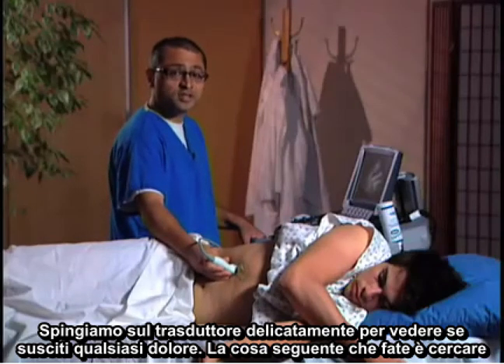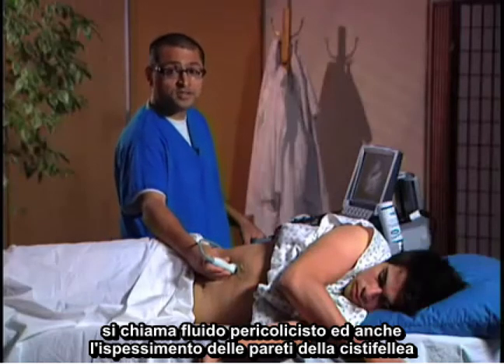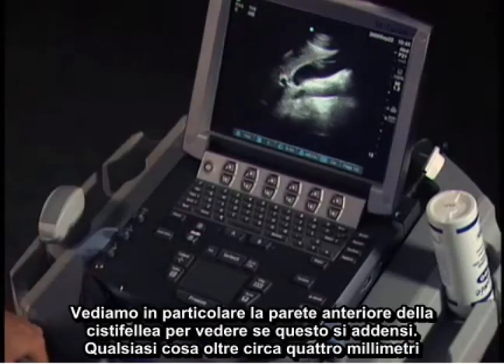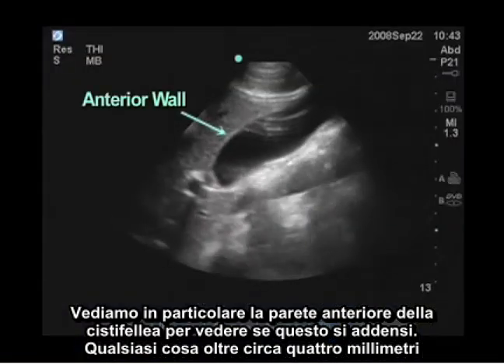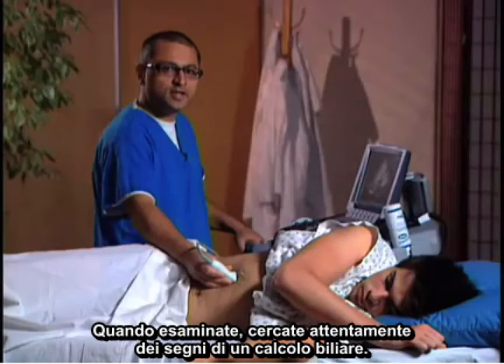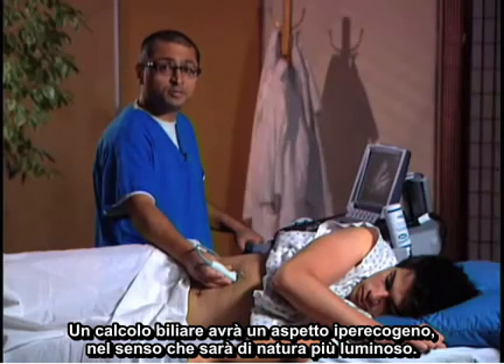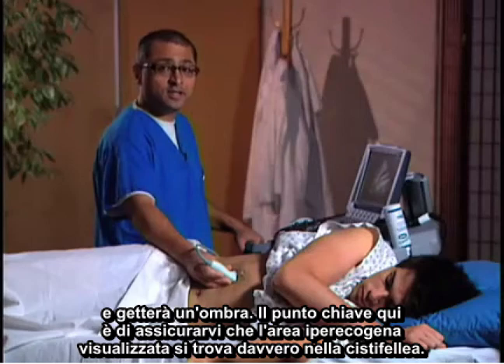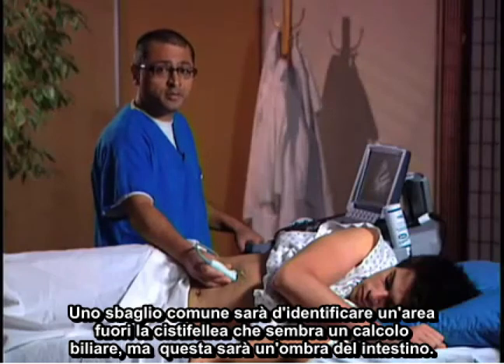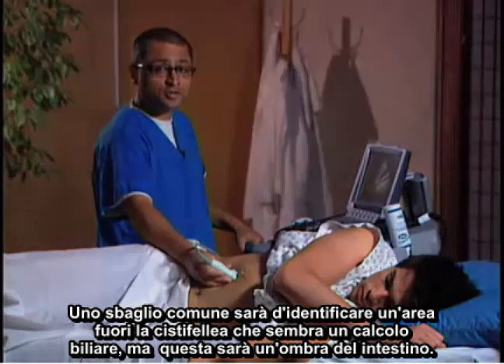Next, look for signs of inflammation of the gallbladder, such as pericholecystic fluid around the gallbladder and gallbladder wall thickening. Look particularly at the anterior wall of the gallbladder — anything above four millimeters or so would be a sign of gallbladder inflammation. A gallstone will have a hyperechoic appearance, meaning it's going to be brighter and it's going to cast a shadow. Make sure the hyperechoic area actually lies within the gallbladder, as a common mistake is to identify a bowel shadow outside the gallbladder that can look just like a gallstone.